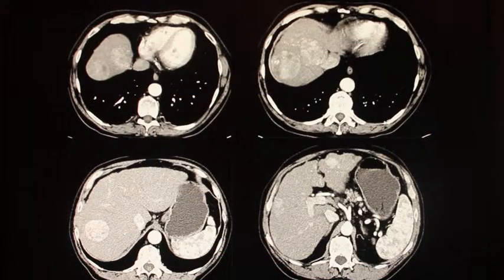This is the CT scan that was performed, and as you can see, he has multiple large, multifocal, bilobed hepatocellular carcinoma, and considering the size and number of the lesions, he is not a candidate for either the Milan or UCSF criteria. So what do we do for this patient?